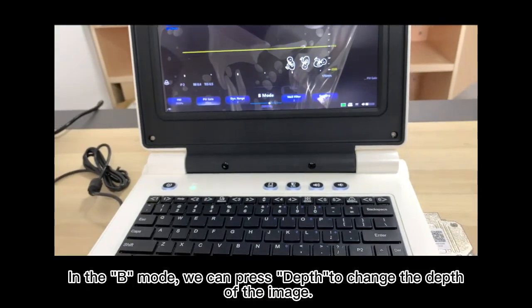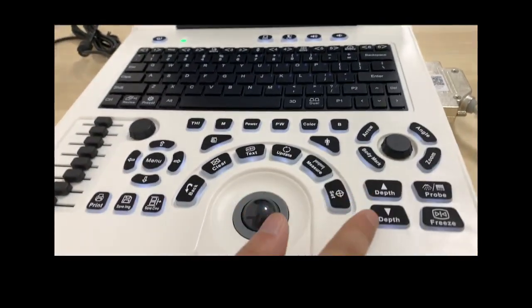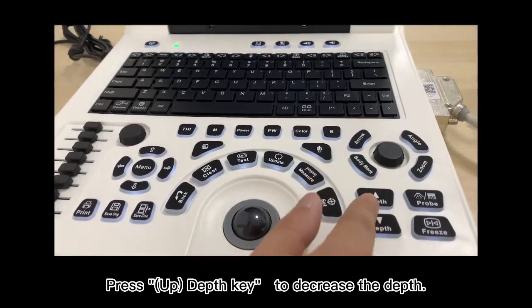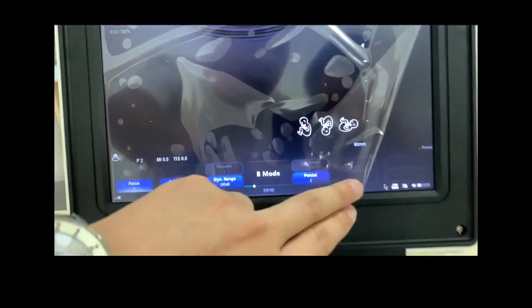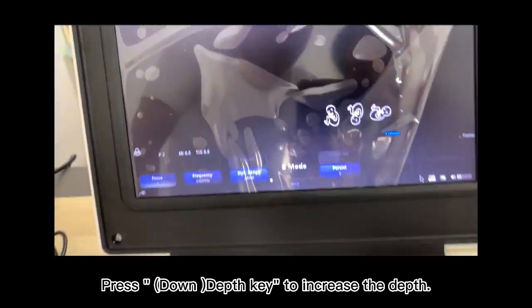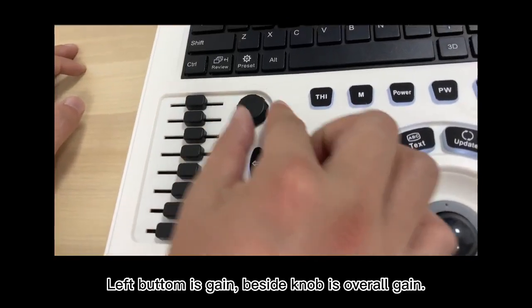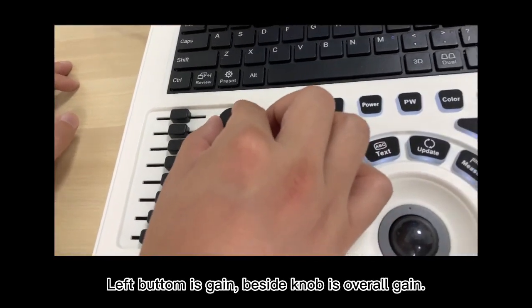In the B mode, we can press depth to change the depth of the image. Press the up depth key to decrease the depth. Press the down depth key to increase the depth. At the left bottom is gain; the knob beside it is the overall gain.